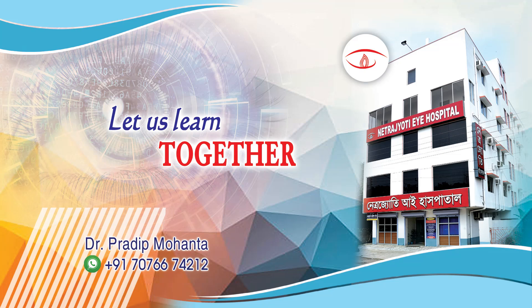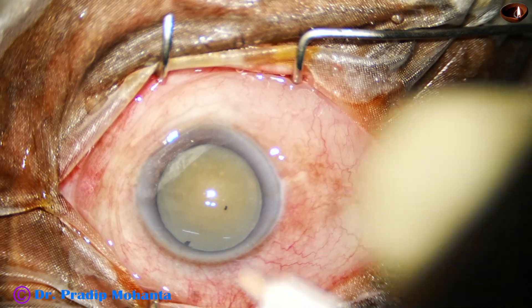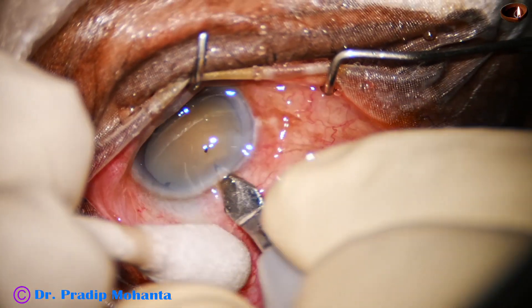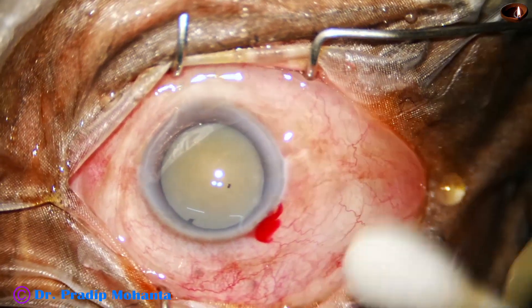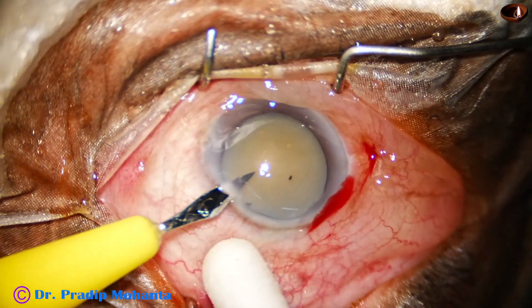To prevent complications in phacosurgery, we have to be watchful during every step of the surgery. This is a hypermature morgagnian cataract. Zonular detachment occurred during surgery. Let us see how the case was managed and how I could prevent a posterior capsular rent in this surgery.